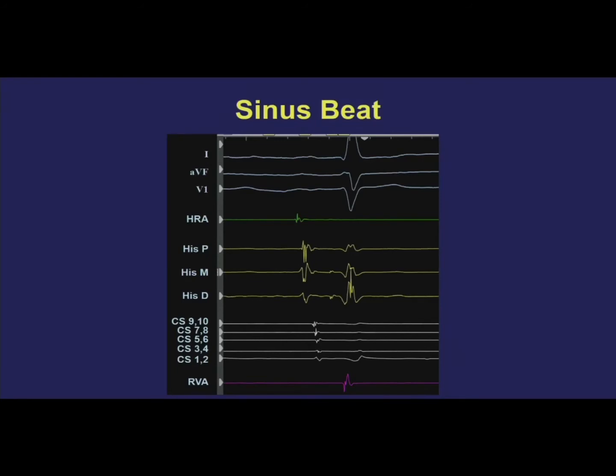And another clue is, of course, the more you veer away from the annulus, you're going to see no atrial signal at all. So the combination of seeing an atrial signal in the His catheter and measuring an HV interval that is physiologic in the range that we would expect tells you that it's likely a His bundle recording. If you don't see an A and this interval gets shorter, this is later, it suggests that you may have advanced the catheter and you're recording from further downstream, closer to where it exits to the ventricle.